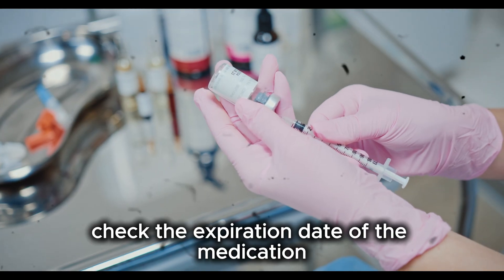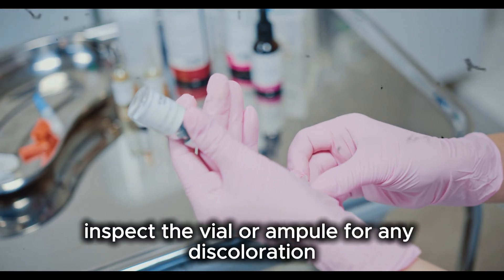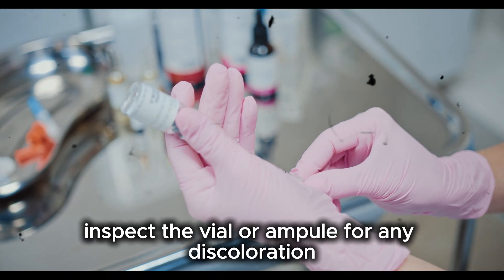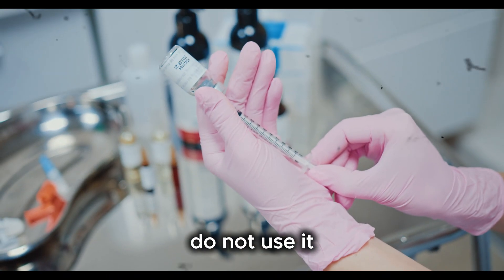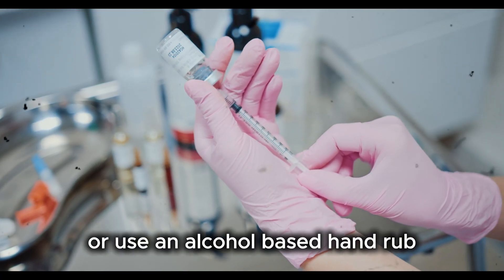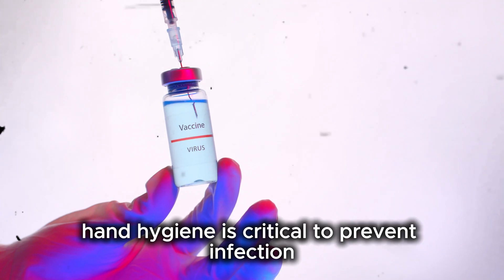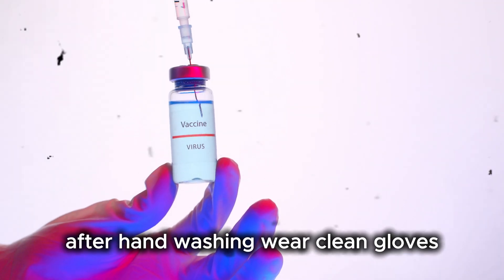Check the expiration date of the medication. Never use expired medicine. Inspect the vial or ampule for any discoloration, particles, or cracks. If anything looks unusual, do not use it. Wash your hands thoroughly with soap and water or use an alcohol-based hand rub. Hand hygiene is critical to prevent infection. After hand washing, wear clean gloves.